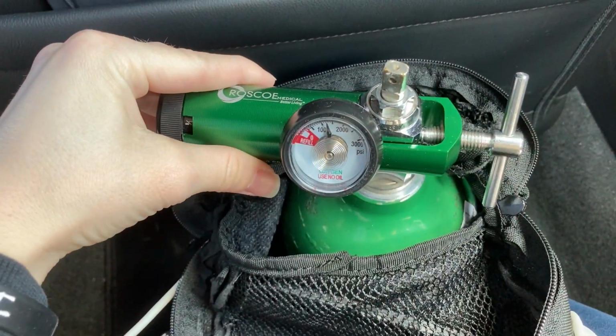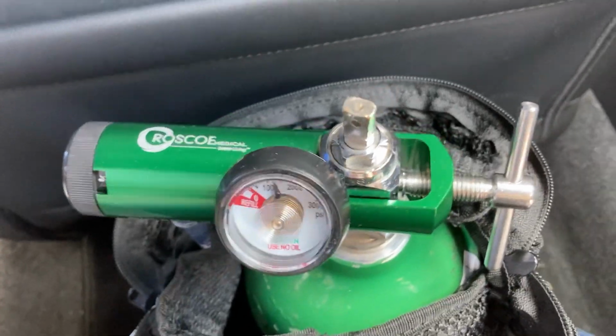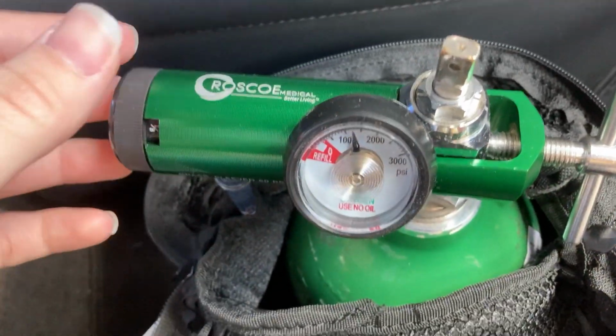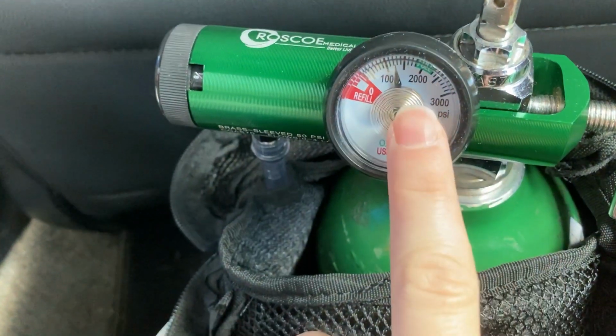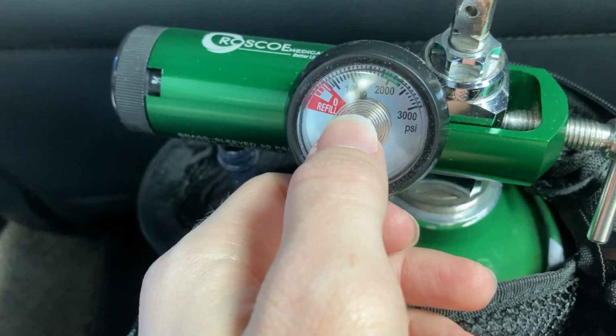So right now we're on the way to my oil change and to do some laundry at my parents' house. But while we're on the way, I figured I'd show you how to use his travel oxygen, because it didn't take us too long to learn it, but I honestly had no idea what to do. This piece right here is interchangeable. It unscrews and you can move it from tank to tank. It's pretty self-explanatory. You just unscrew this, and then there are two little things that punch in. Right now you can see we're about halfway full, which means we have about 15 hours left.